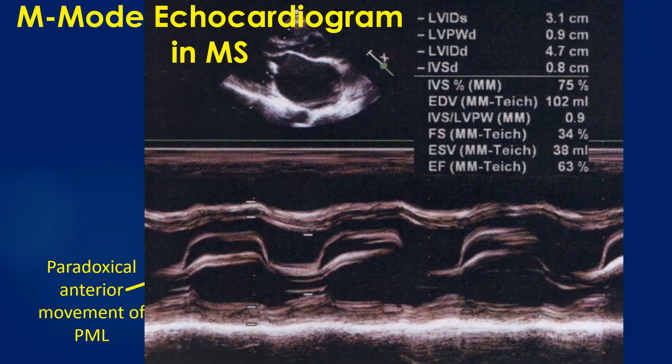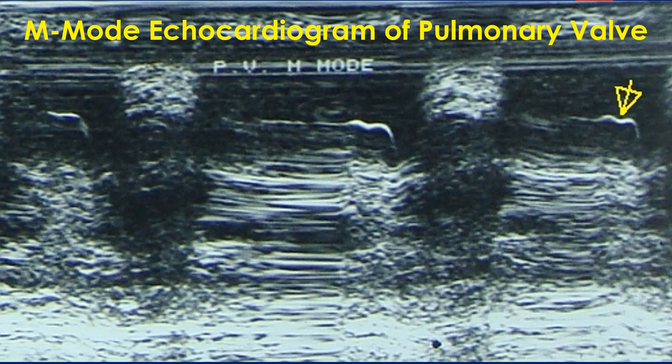The M-mode echocardiogram in mitral stenosis shows the flat EF slope and paradoxical motion of the posterior mitral leaflet. Normally, the anterior mitral leaflet shows an M-shaped anterior movement and the posterior mitral leaflet shows a smaller W-shaped posterior movement. The upper panel shows the doming of the anterior mitral leaflet in diastole. Mitral stenosis with pulmonary hypertension is evidenced by the flat EF slope of the pulmonary valve M-mode echocardiogram and a shallow A wave marked by the arrow. A mid-systolic notch may also appear in severe pulmonary hypertension.